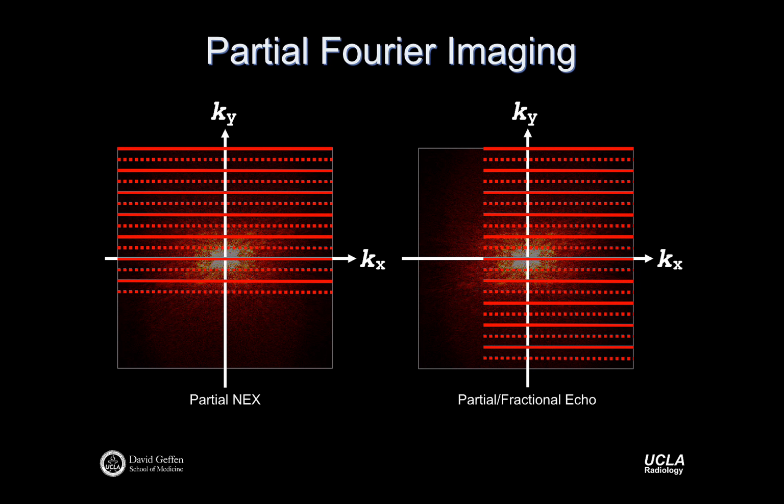Yeah. So we still have high spatial frequency data. We just didn't get its Hermitian conjugate pairs, but we still have the same resolution. So in principle, resolution is maintained. We're just scanning faster. So this is a pretty simple fast scanning approach: just asymmetrically acquire data in the phase encode direction. And you can go 25% faster, all the way up to, but not quite, say, twice as fast. We need to have a little bit more than half of k-space. So that's pretty good.